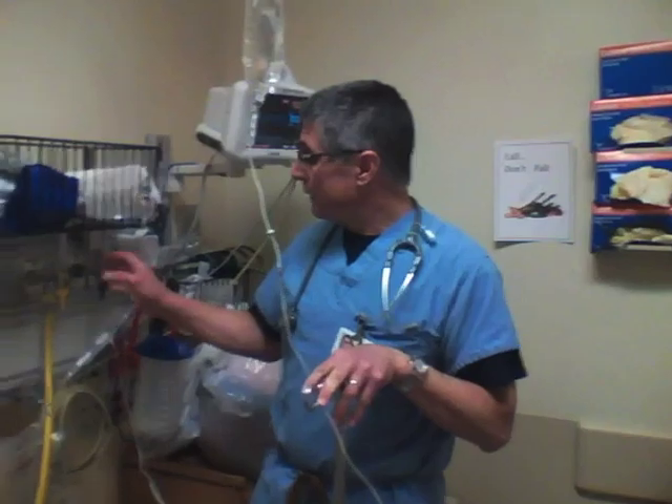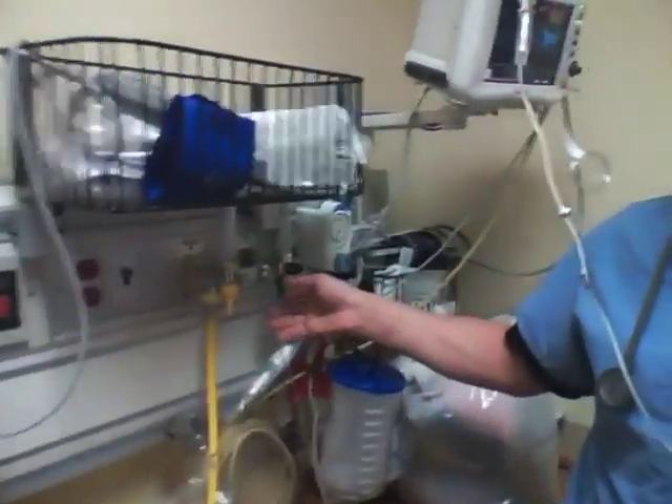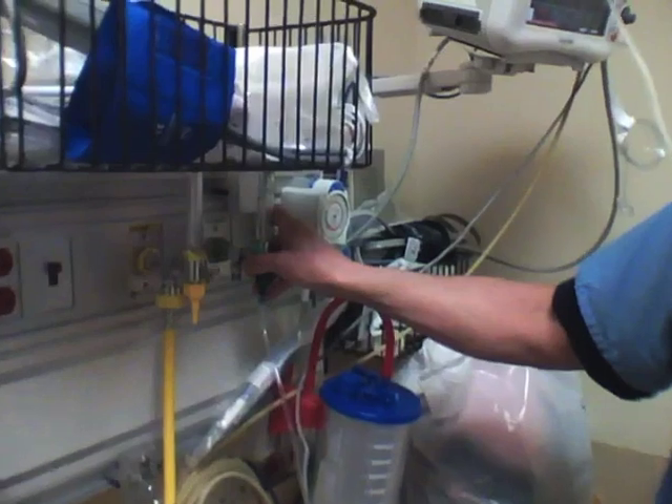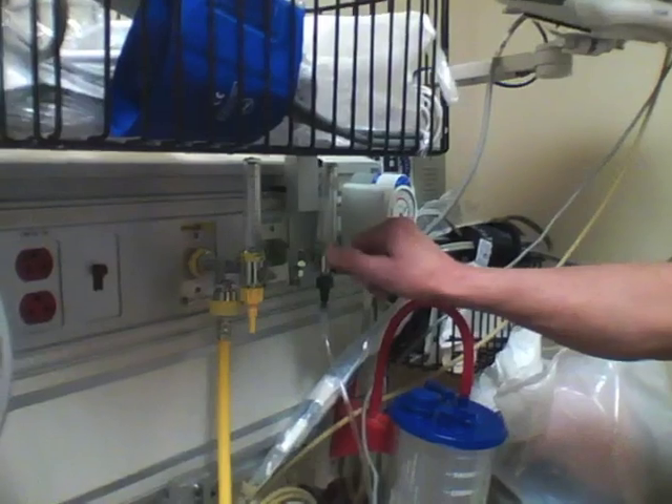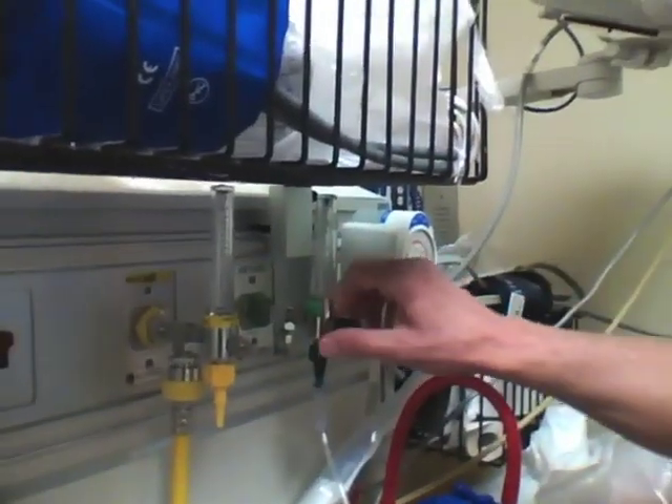With this technique, here's what's going to happen. We take and put nasal prongs on the patient, hook them up to a regular regulator but turn it up as high as it'll go. You can hear it hissing in the background — scares the bejesus out of the patient too.